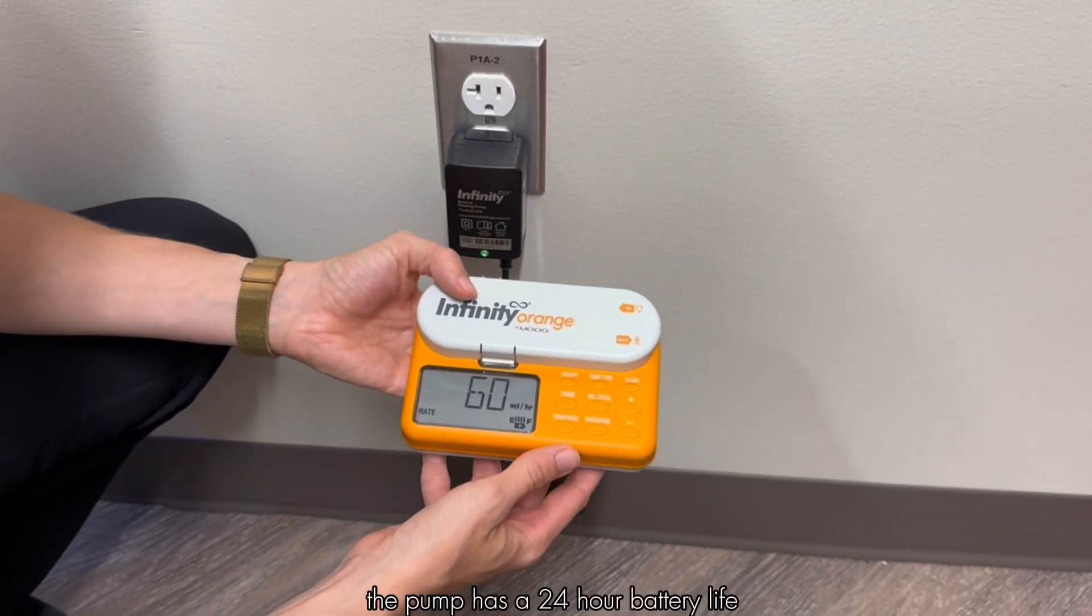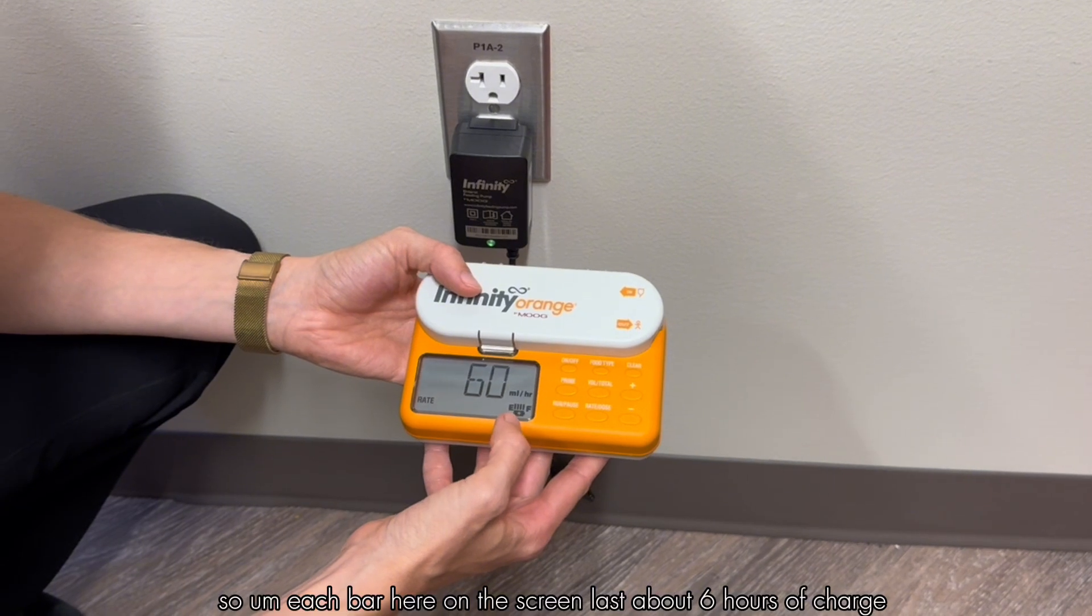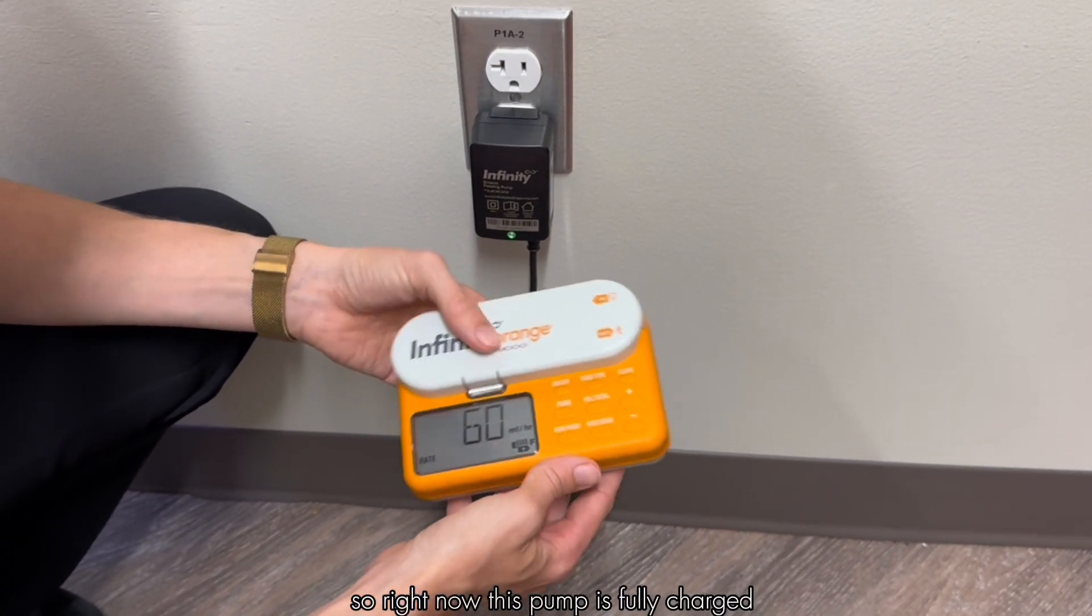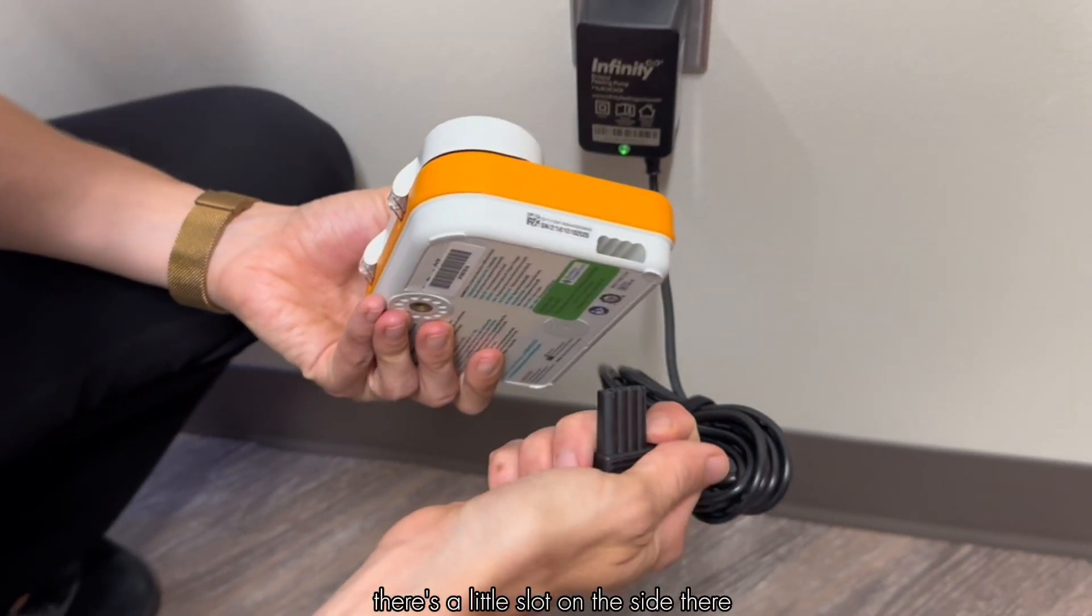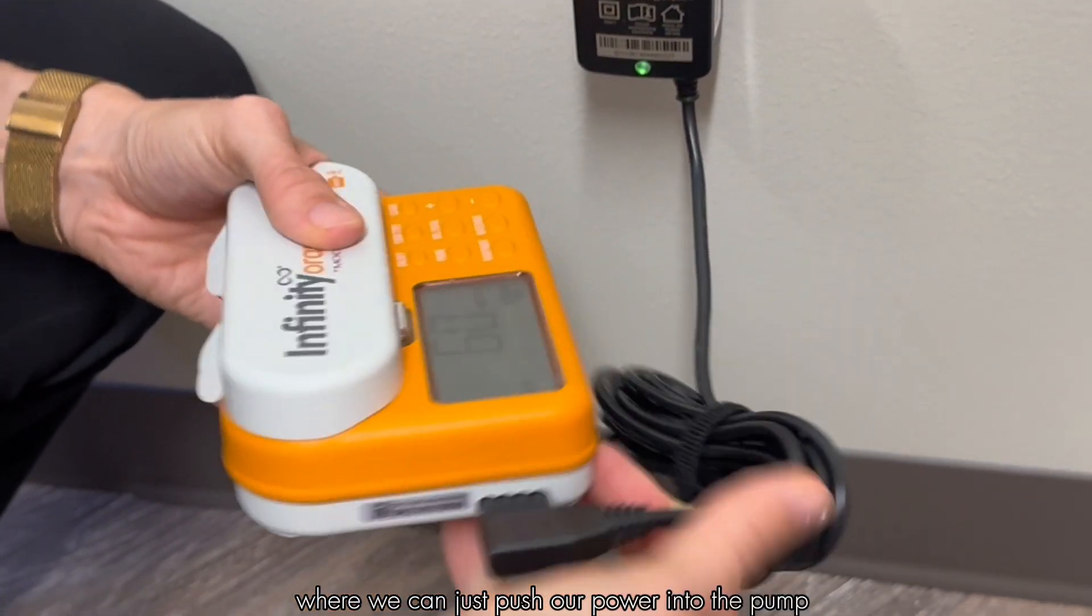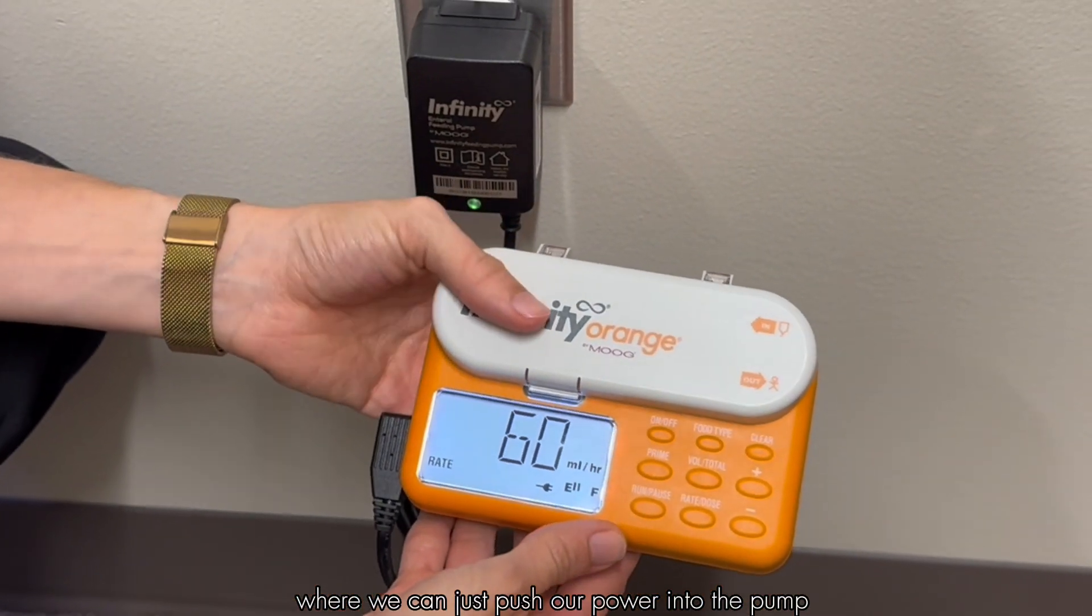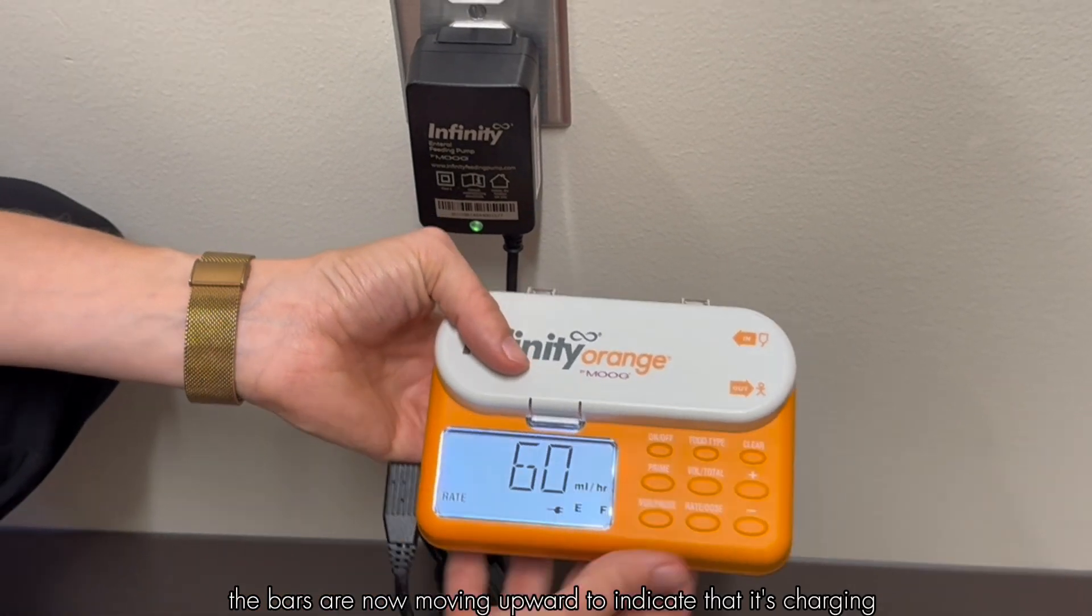The pump has a 24 hour battery life so each bar here on the screen lasts about six hours of charge. Right now this pump is fully charged but when it does get low you can plug it in. There's a little slot on the side there where we can just push our power into the pump and then you can see the bars are now moving upwards to indicate that it's charging.